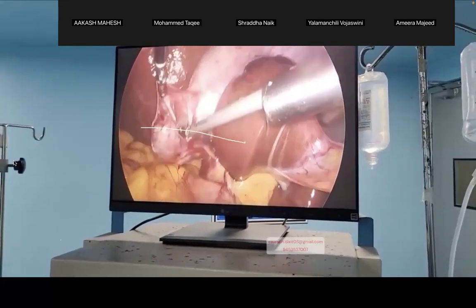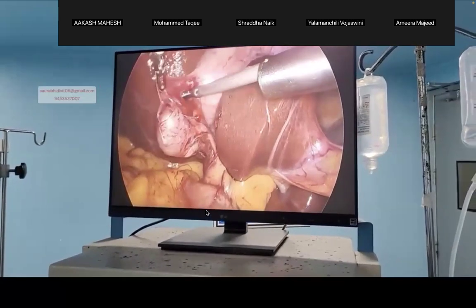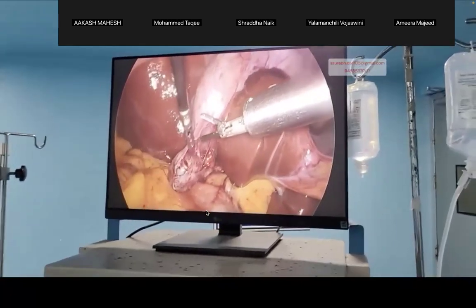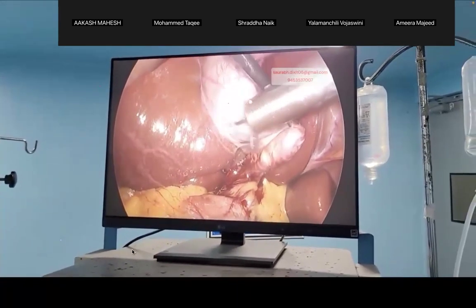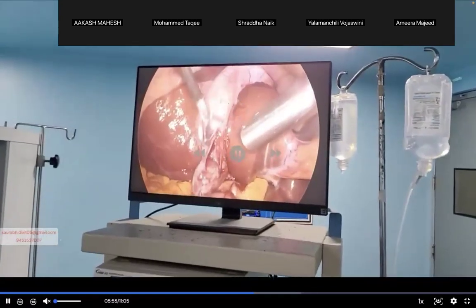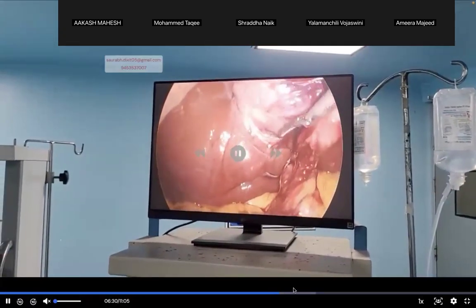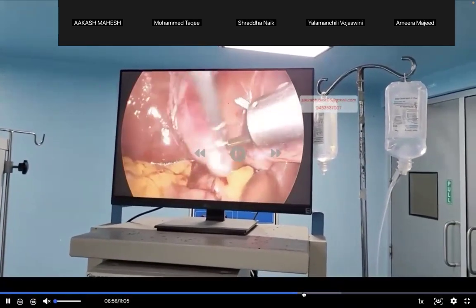But again, there is abnormal anatomy. So very soon you should see that thing. So what is the next task? To open up the posterior window of safety. You will see that there's a duck-shaped gallbladder. Very soon you will see that this gallbladder is having a very abnormal shape. So just try to understand this. Very simple, very simple. So let us move forward. In this, you are seeing we don't have a proper anatomy, but just see.